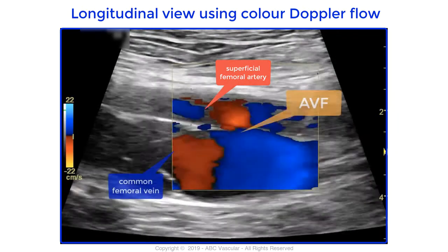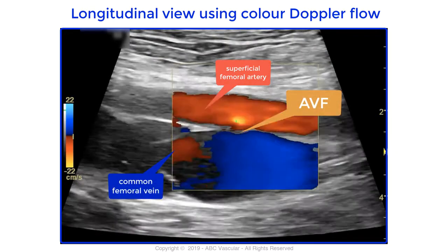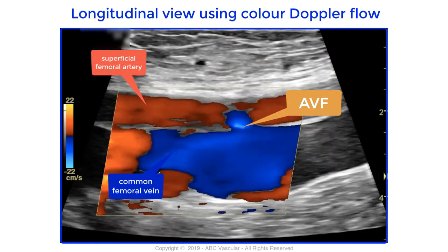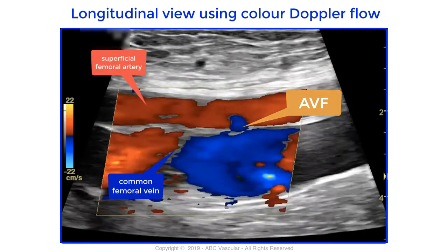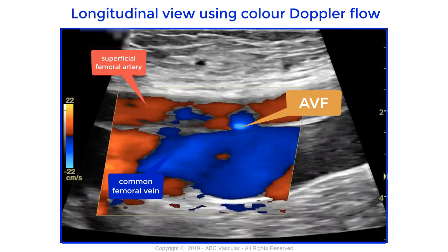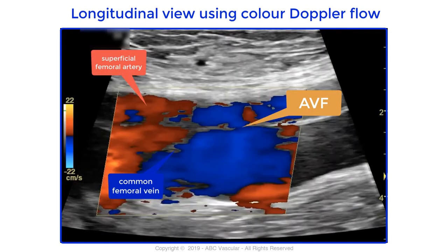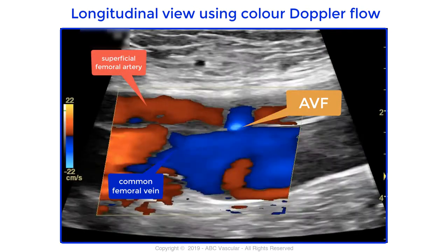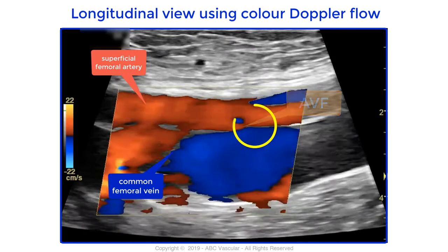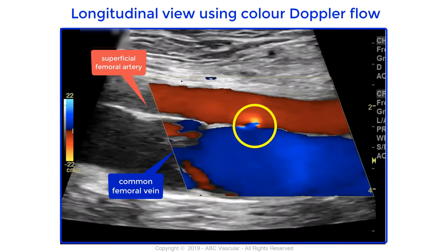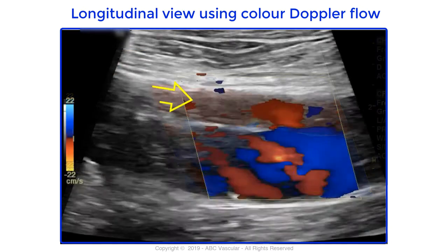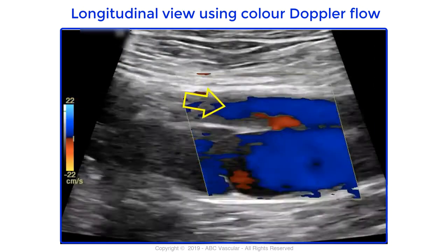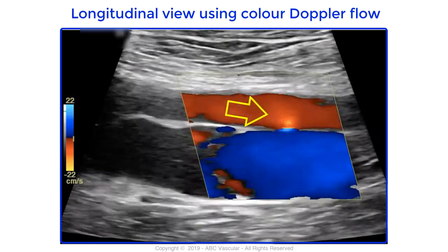A communication between these two vessels via an arteriovenous fistula is demonstrated. The arteriovenous fistula is detected using color Doppler flow by the presence of color Doppler flow aliasing at this level.